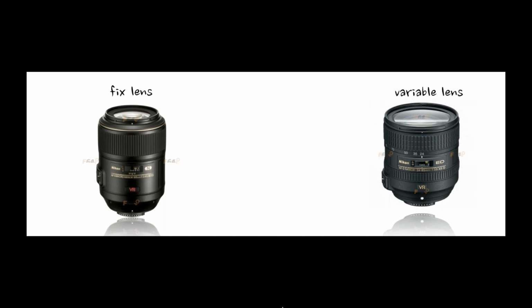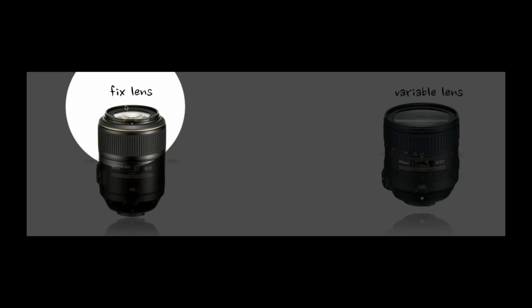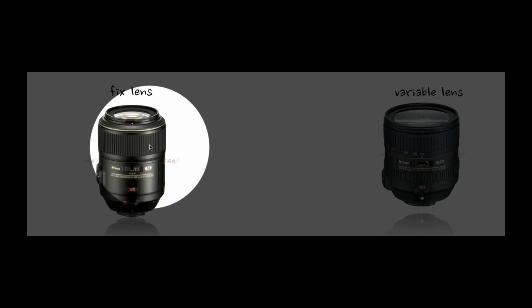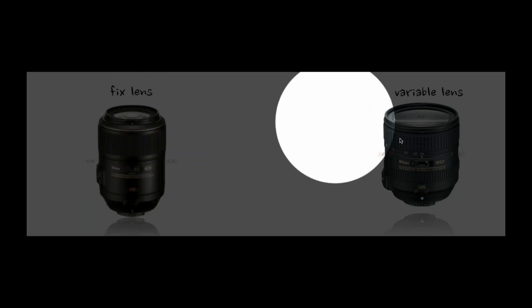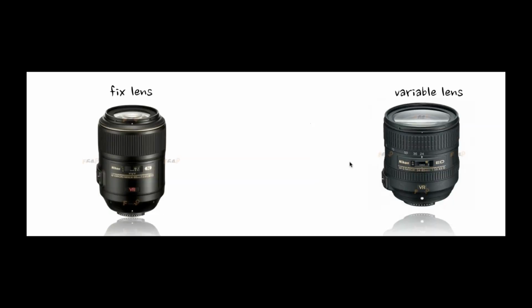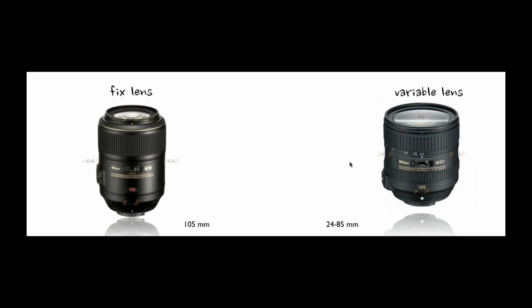Now, years ago, change is good. I would have told everybody to stick to the fixed lenses because they were better for macro photography. And I really felt like it controlled what we were doing. Today, I've switched to more of the adjustable lenses. Part of that was an influence from a friend of mine from Romania, but also part of that was really just because I saw a lot more uses out of having one good lens than having to switch lenses or use different cameras over the years.